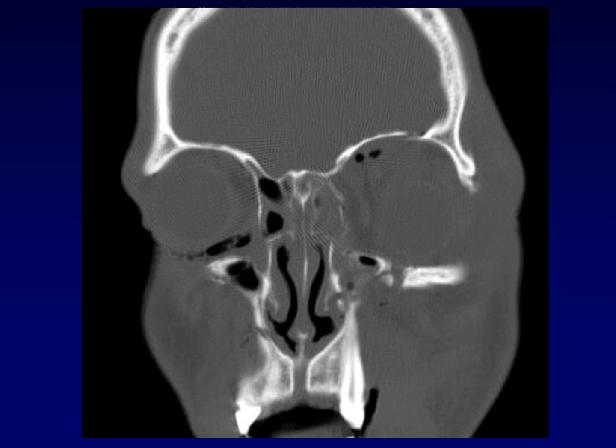This example illustrates the extent of the fracture to the orbital rim. Notice how the fracture is all the way out at the rim of the orbit — that's the most anterior aspect, right where the bone ends. This is important because when surgically repairing these fractures, a new shelf is placed to replace the orbital floor, and that shelf needs to rest on something. Knowing whether fractures go all the way to the orbital rim, and whether they extend all the way back to the orbital apex, is an important aspect of assessing these fractures.